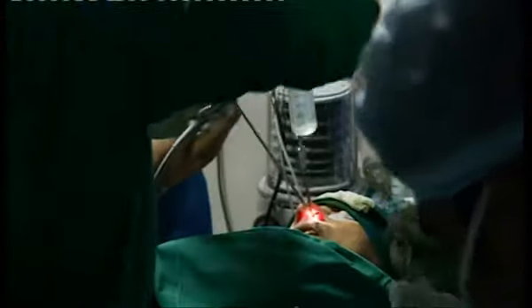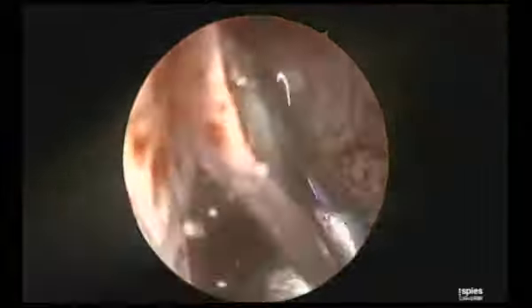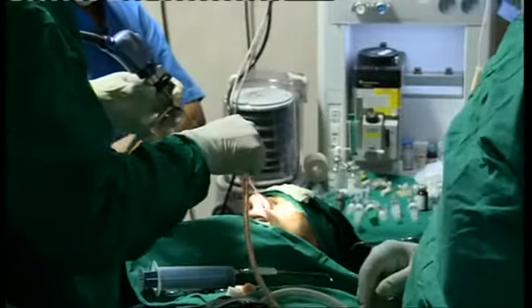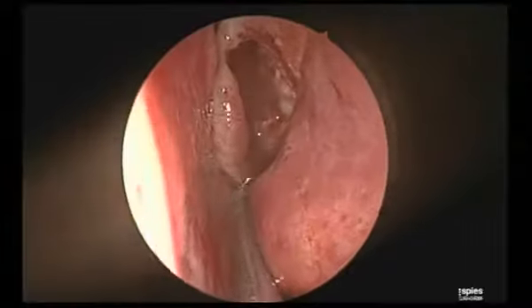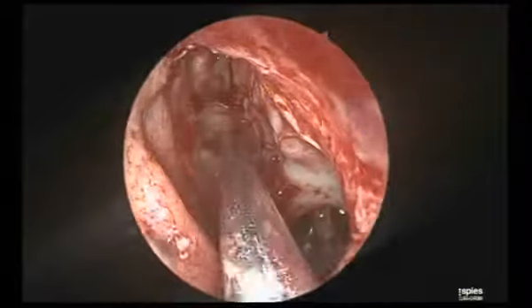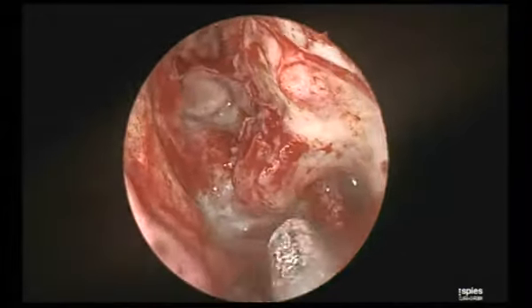Surgical field is the most important determinant in terms of avoiding complications. If your surgical field is not good, see, everywhere I am only concerned with the landmarks. Every time I need a new landmark to go ahead. Got my point? Now see, I changed to 0 degree for better orientation for everyone.